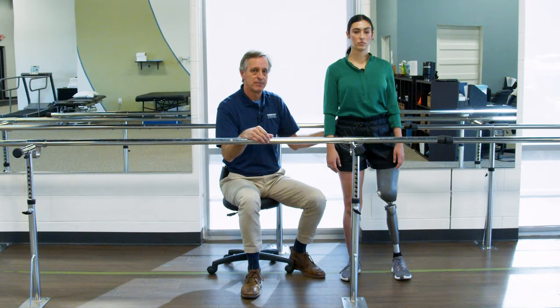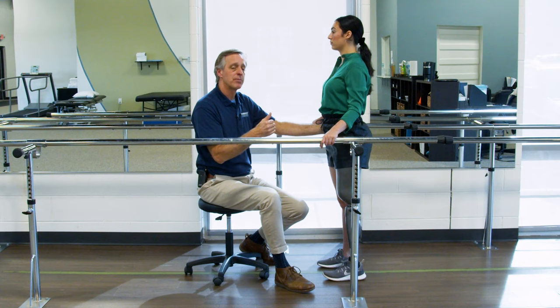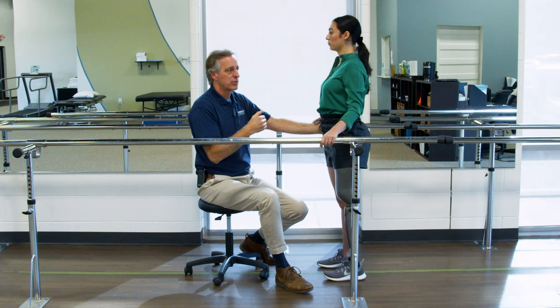So once we've got somebody sidestepping and they've got good braiding steps, the next thing we want to work on is step variation, step speed variation, step length variation. Why? Because if I teach somebody one walk, they're walking in one gear all the time. And that's just not the way life is. There's places where you need to short step quickly, and there's other places where you need to long step to cover ground in a more rapid fashion.